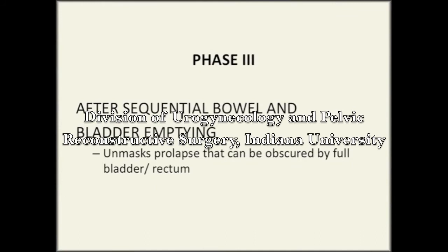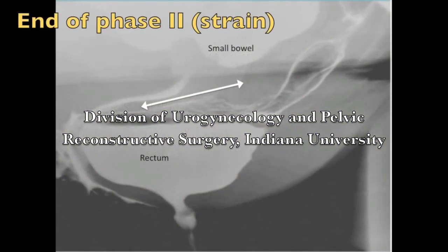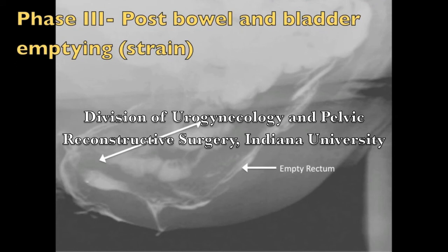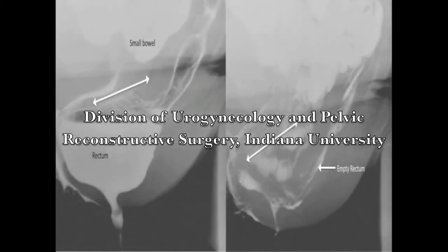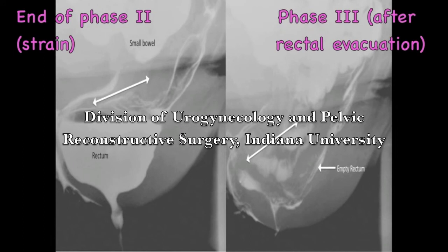The final phase of the triphasic technique involves evaluation of prolapse after bowel and bladder emptying, performed to unmask prolapse that could be obscured by the bladder or rectum. Although bladder emptying is performed on everybody, additional steps to evacuate the rectum are not necessary in patients who can empty the rectum satisfactorily during phase 2. This patient has a large contrast-retaining rectocele at the end of the defecatory sequence with a relatively normal-appearing rectovaginal space. After the patient performed maneuvers to evacuate her rectum, a large enterocele is seen in the rectovaginal space. If a large rectocele requires the patient to digitate in order to empty rectal contents, she should be allowed to do so and prolapse should be re-evaluated.